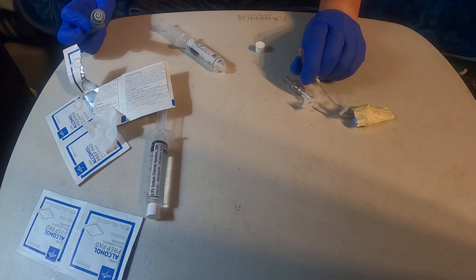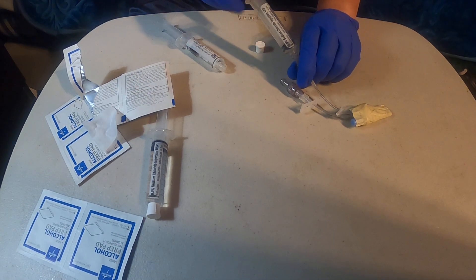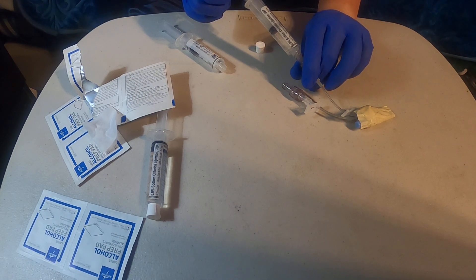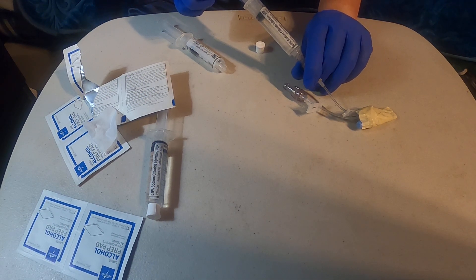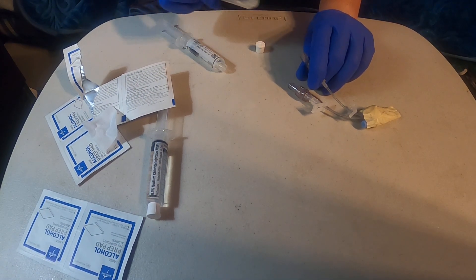Next, what you would do is get a clean sterile syringe, go ahead and attach it, and draw back the amount of blood that you need depending on the test that you're running. Certain tubes require a certain amount of blood. This syringe is only 10mls and is perfect for what we need. Put it to the side in a clean area.